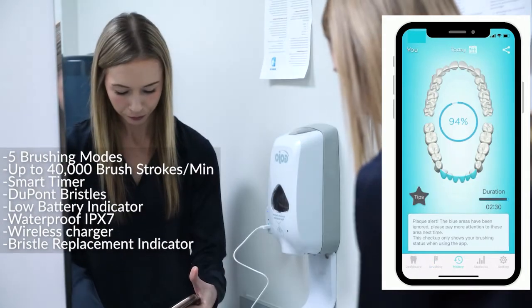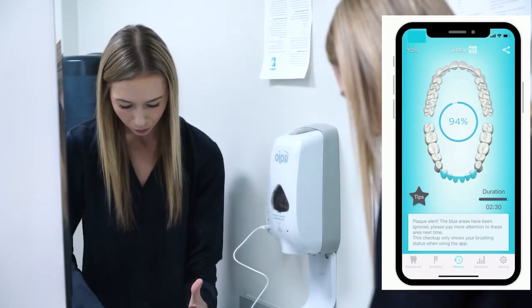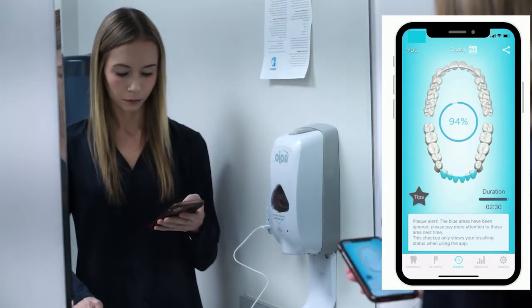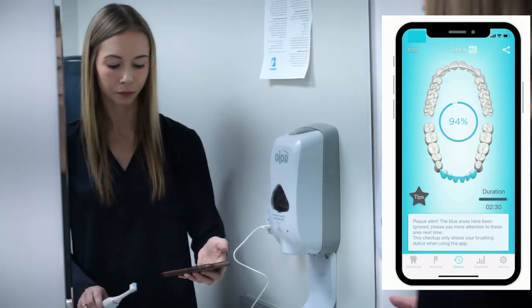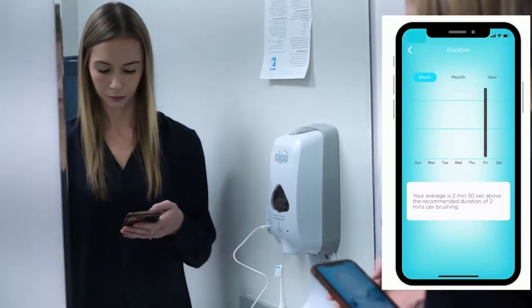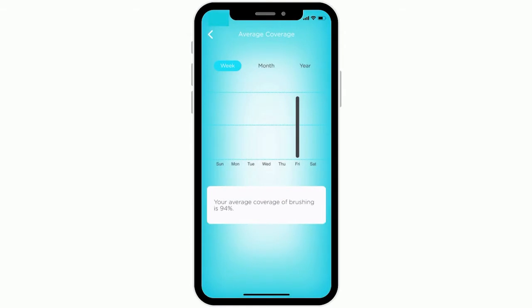And as you can see here, I have now completed my brushing, and for the purpose of the tutorial, I did leave the zone missed, so you guys could see what it would look like if you missed a zone when brushing your teeth, and also if your child missed a zone. You will get 10 minutes to go back to fix this brushing habit to get 100% when brushing.